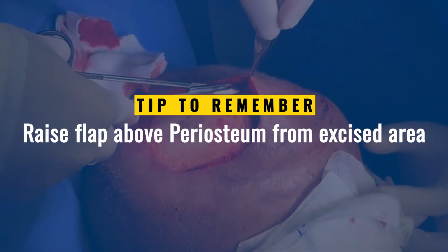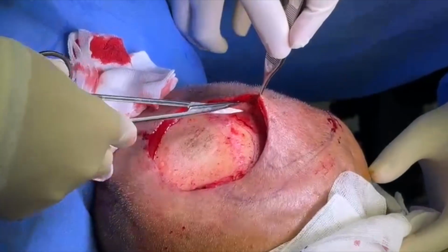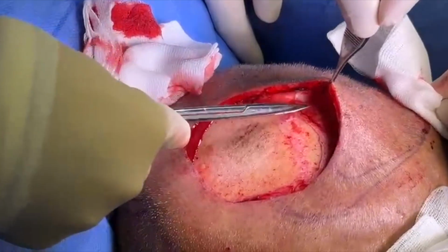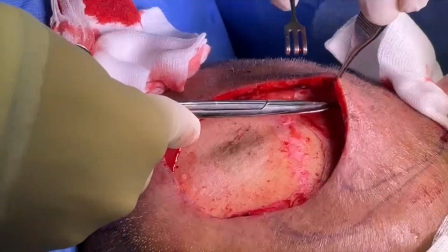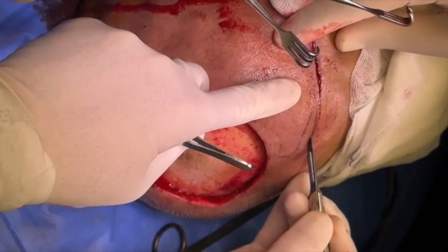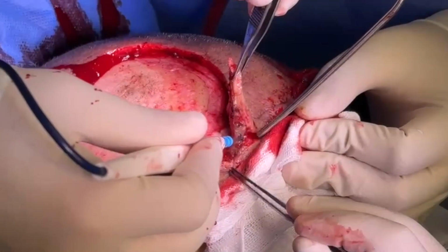Now you already have a plane from where you excise the tumor and you can elevate your flap above the periosteum surrounding that area, and this will help you in raising the flap later. Once this plane has been developed, skin incision can be given and flap raised. Flap is now easily raised above the periosteum.